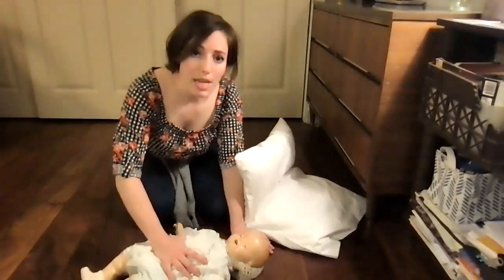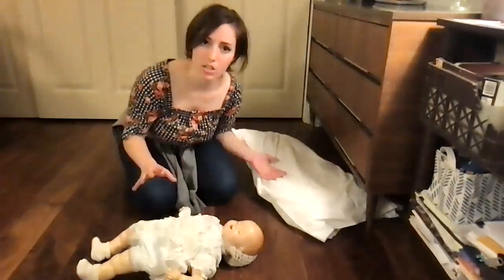And you are going at 100 to 120 beats per minute. Counting out loud helps a lot if you're switching off with people. After you do your 30 compressions, then you are switching to giving them a breath. I'll do this on the baby.